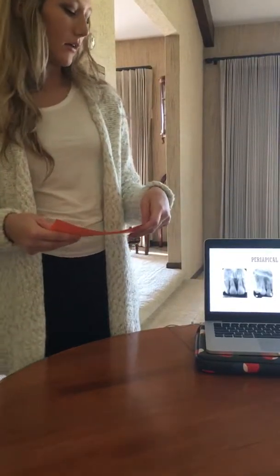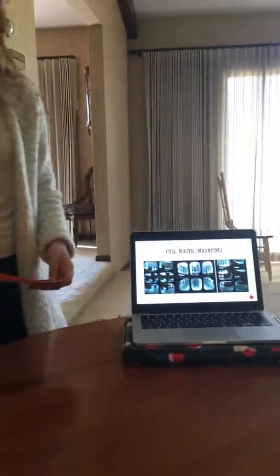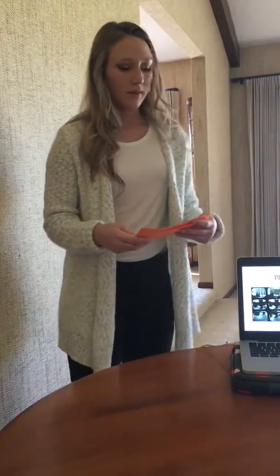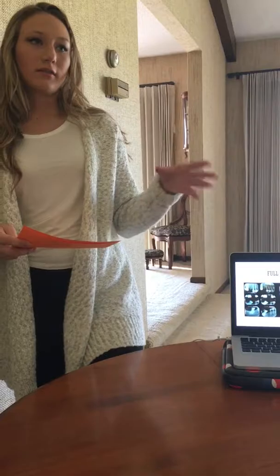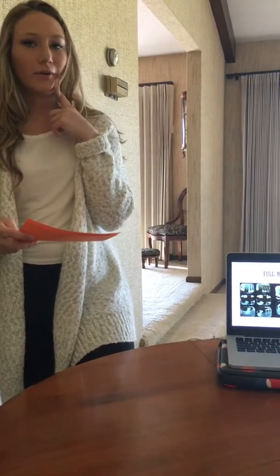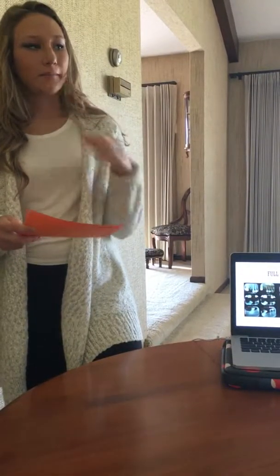When we put all these together, we put the bite wings and the PAs together, will form a full mouth x-ray, which is shown in the next slide of your handout. These will go together, and in clinic at NDSCS we do the 16-4, which means that there's 16 PAs and 4 bite wings. So the premolar and molar bite wings, and then the PAs, which are 5 on top, and then 4 on bottom.